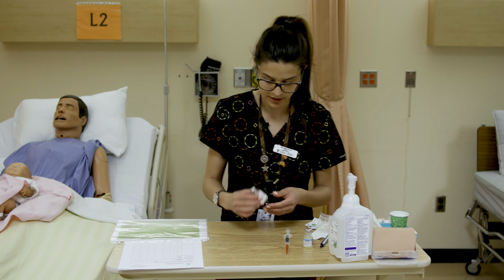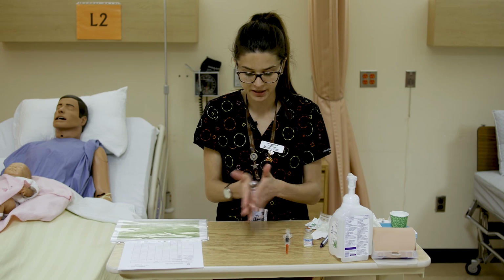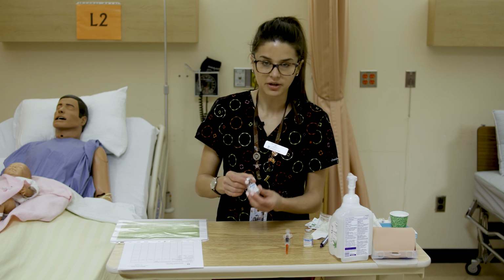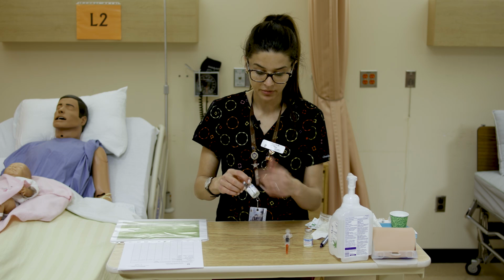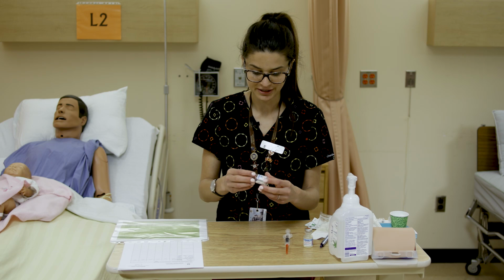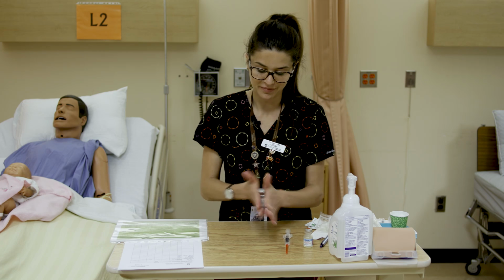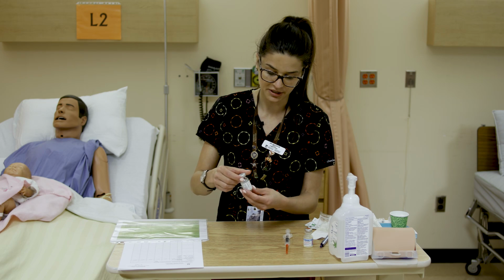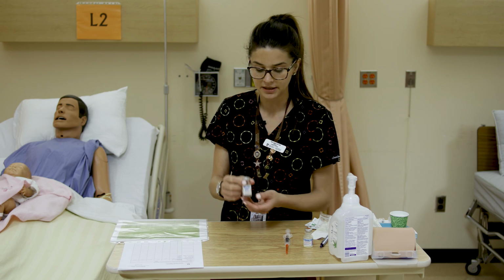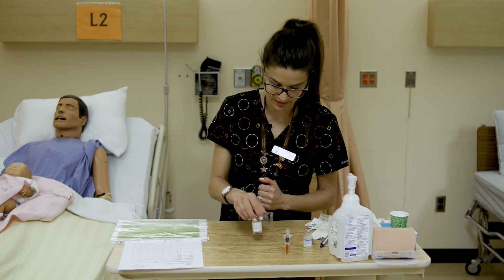We'll just put this aside for now. So we're going to let that medication mix in there. Similar to insulin, you can kind of help it along by gently rolling it in your hands to help it mix. Some reconstituted medications will dissolve or dilute a lot faster than others, and you'll just start to get to know that. So give yourself enough time if a medication needs to be reconstituted, give the medication enough time to dissolve. And you want to make sure that it's completely dissolved with no sediment in the vial when you're ready to draw it up. So we sort of have a fast dissolving one and it's all mixed in there now.